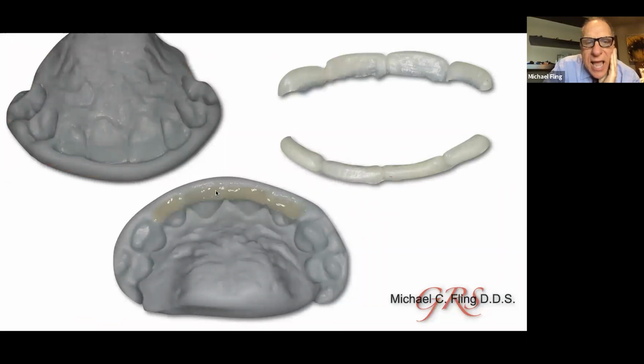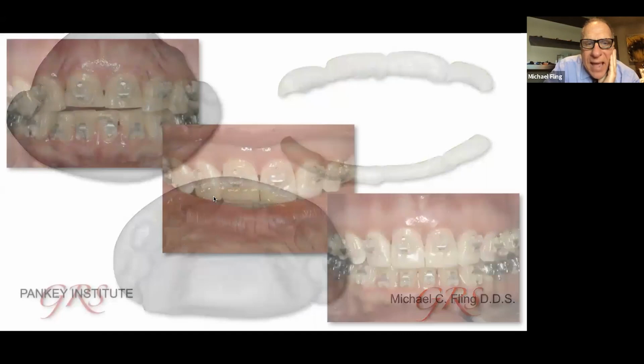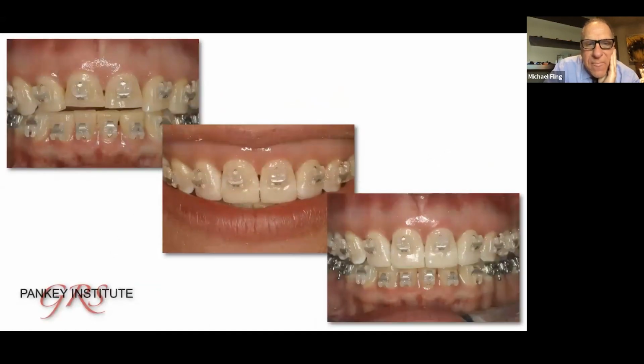Here you see me adding the composite down the facial. I will cure it. I add a little in the lingual. And usually when I add up the lingual wall, it will meet in the incisal, and you cure it and you've got a shell. It needs to be hollow in the middle. I'm going to trim it until it passively fits. I'm going to put packable composite inside. I'm going to seat this in place. I'm going to trim these up just as I described with my flowable composite.